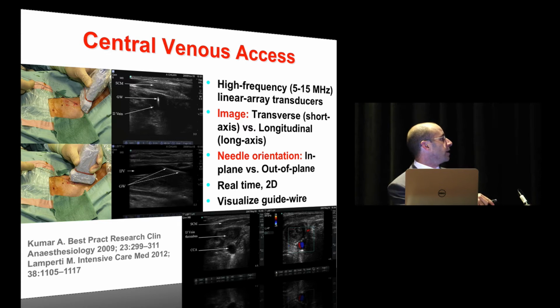I prefer an out-of-plane approach to at least get into the space, but it is very, very important when you're in your vessel to be able to see the guide wire, because there have been many reports where you see it nicely, you thread it through, and it's actually gone through the vein. So it is very important to see the guide wire, and it's not a foolproof technique unless you do that.